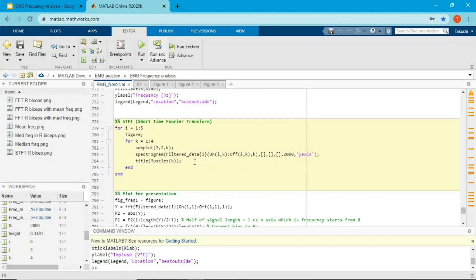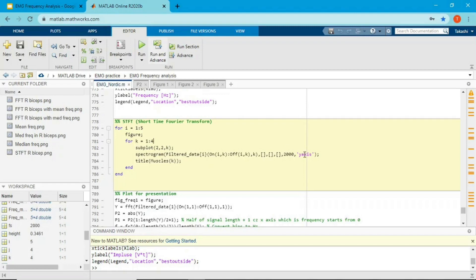For Short Time Fourier Transform, MATLAB makes it very easy — just use the function called spectrogram. The first input argument is filter data defined from muscle on to muscle off. The second input argument I left as default using square brackets. The third and fourth input arguments follow, and the fifth is 2000 for the sampling frequency used with this EMG.